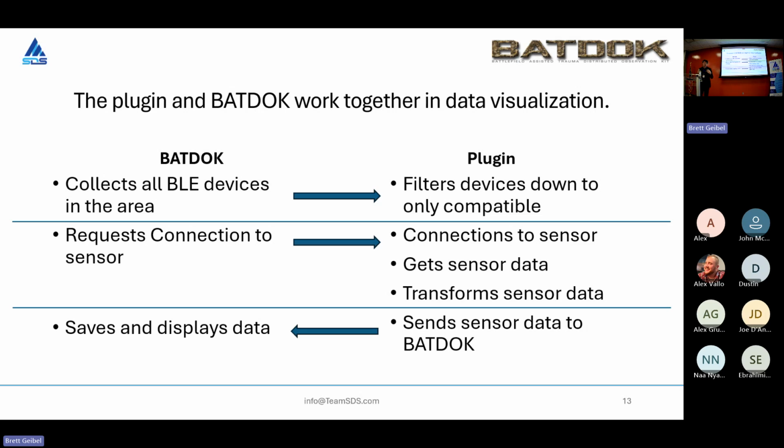So essentially, you have your BATDOK application, which your medical providers will understand, and they will take your plugin and install it into the system. It's very minimal effort. Anybody who has any familiarity with BATDOK knows how to do that. They install the plugin, and as soon as they install that plugin, BATDOK will instantly start searching the area.